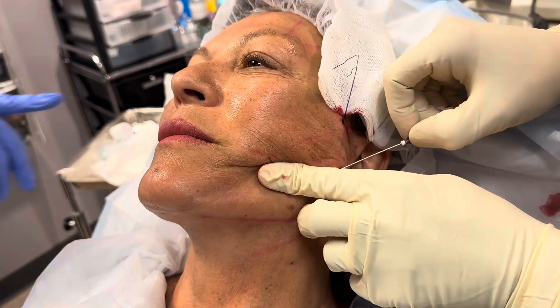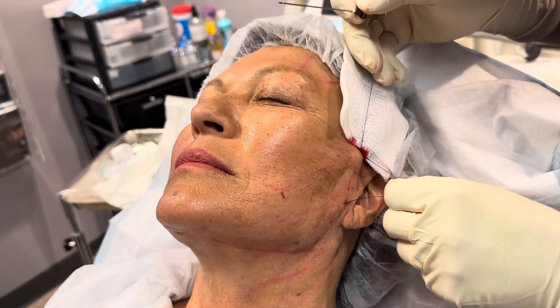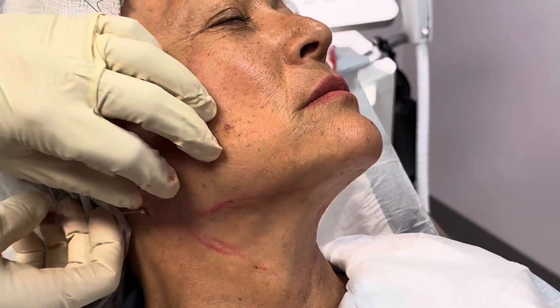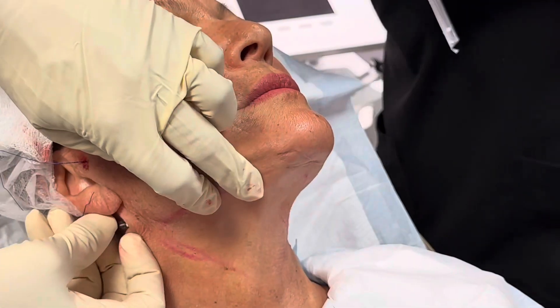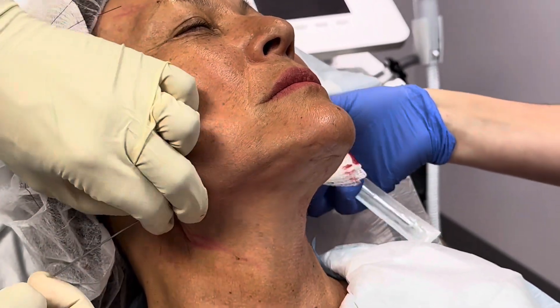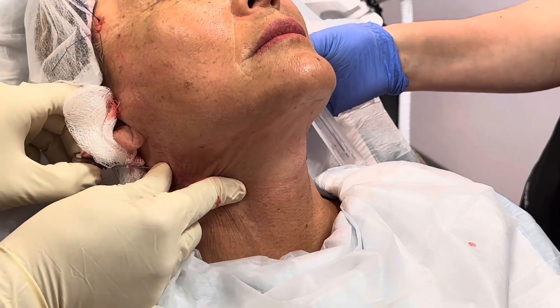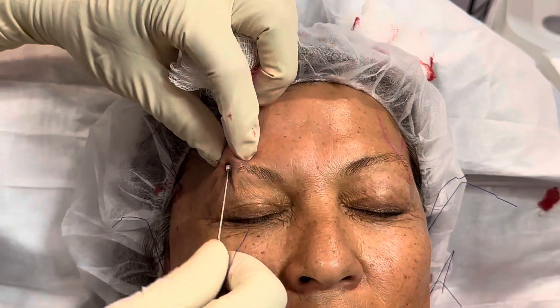The barbs on the thread will hold the skin back and up when you pull it tight. We can do the same thing on the neck — put the threads in to define that jawline and pull the neck up. This is going to give you a nice tightening on the neck without having to do a surgical neck lift. Here's another thread going into the lower part of the neck; this will help that loose, crepey skin on the bottom of the neck. We're going to take those two and pull it back.